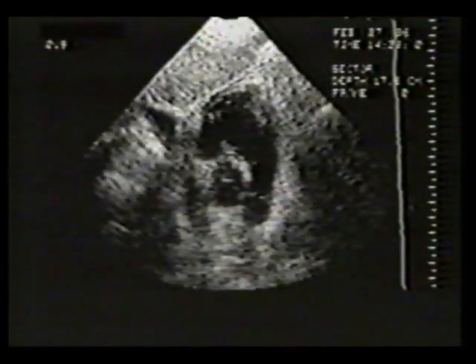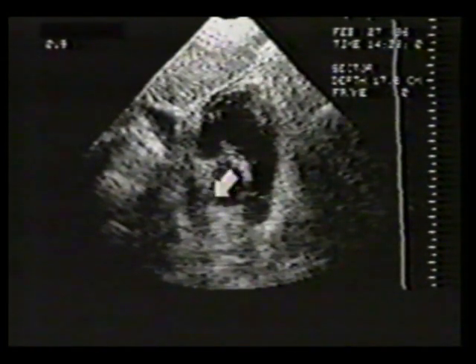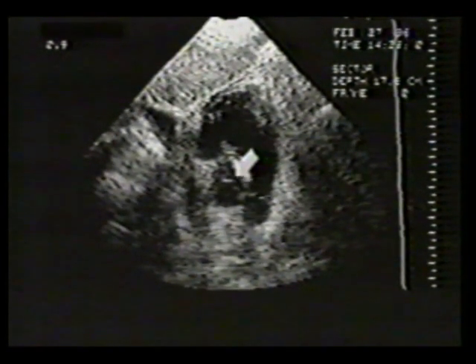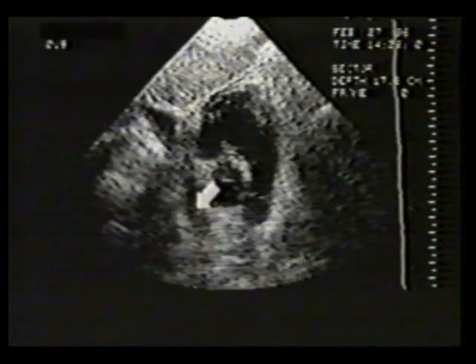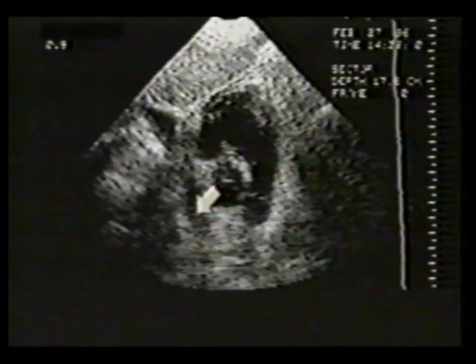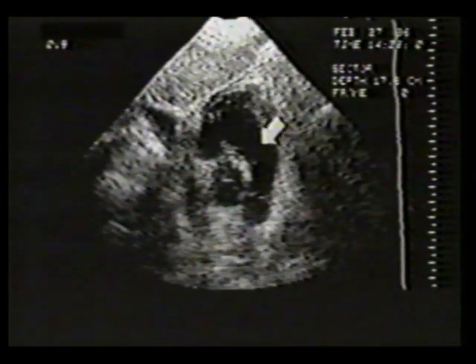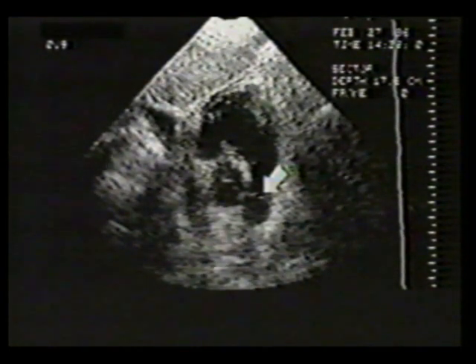We will now scan to the base of the heart. The aortic valve is immediately apparent in short axis. It is not usually as easy to identify the three aortic cusps from the subcostal position as it is from the peristernal. The left atrium is behind the aortic valve. Note the tricuspid valve leaflets and the right ventricular outflow tract, which leads to the pulmonary valve. Beyond the valve is the main pulmonary artery.